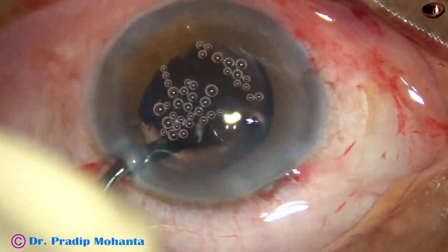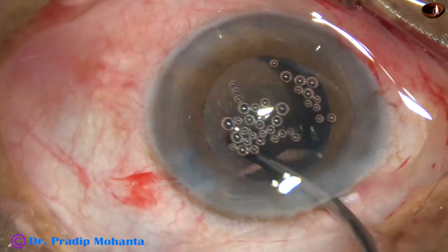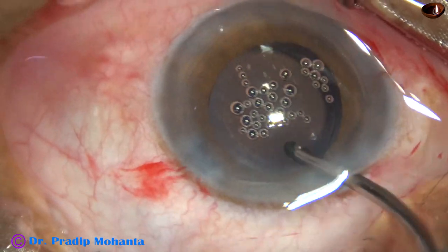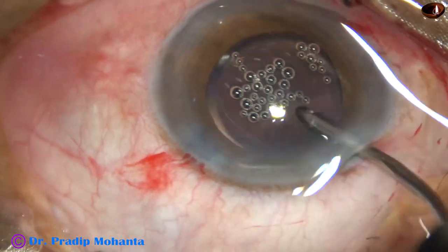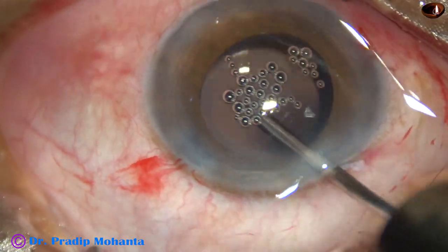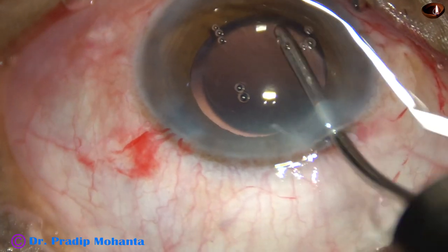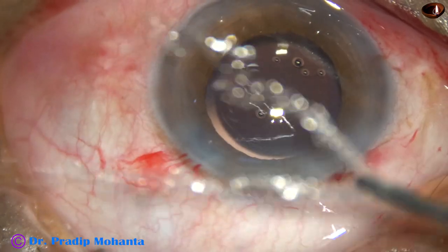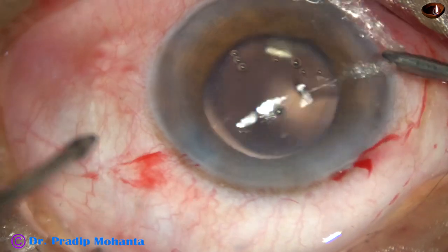After cortical cleanup, this is hydro-implantation of a single-piece hydrophilic acrylic monofocal intraocular lens. The lens is being dialed to loosen any cortical matter — there may be some cortex behind the iris. If we dial the lens several times, the cortical matter may come out. So whenever you are not sure whether you have removed all the cortical matter, you can spin the intraocular lens several times and if there is any cortex, it may come out.